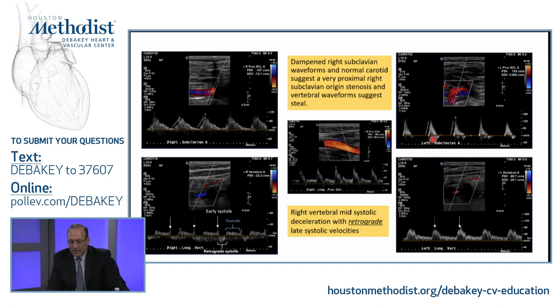What happens on the left side? Look at the left side. Peak systolic waveforms, you know, high resistance diastolic component, not significantly high velocities, okay? And look at the vertebral on the left side, normal vertebral artery, okay? So this is a patient with the origin of the right subclavian artery stenosis with sparing of the innominate because the carotid waveforms are normal, okay? And with reversal of flow in the mid-systolic segment with antegrade diastolic flow.